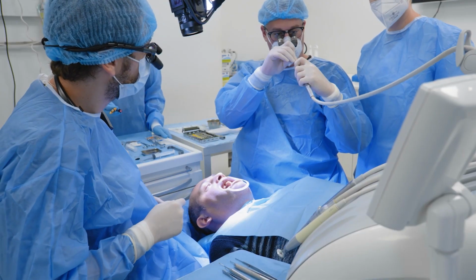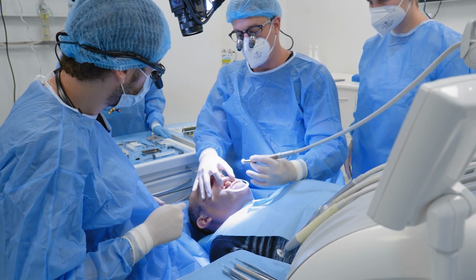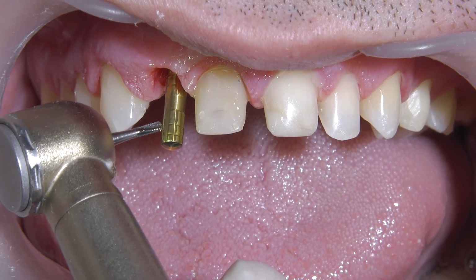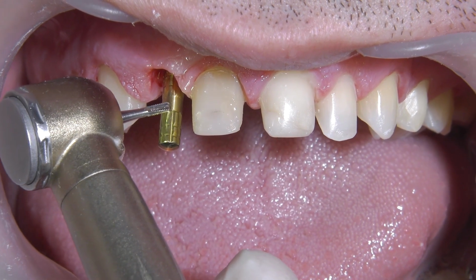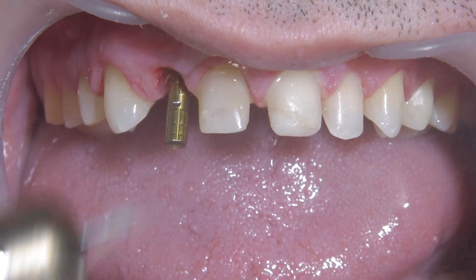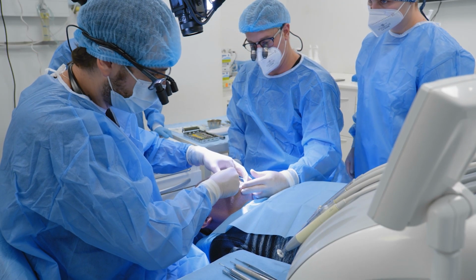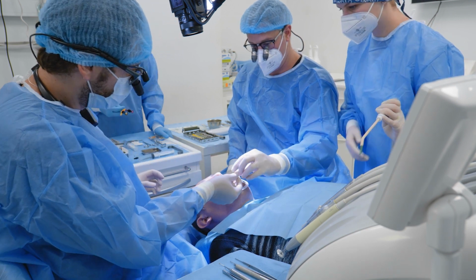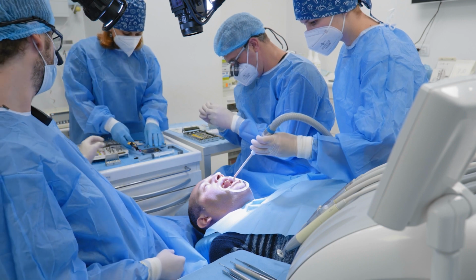My brother wants to cut a little bit of the cylinder first, outside of the mouth. He's just going to do a point in the buccal, so we know that this is the buccal area. Just a small mark. We remove it from the mouth. We are just going to cut a little bit because it's too long. We don't need it. Let's take a metal burr now, and we are going to cut just a little bit of the cylinder.